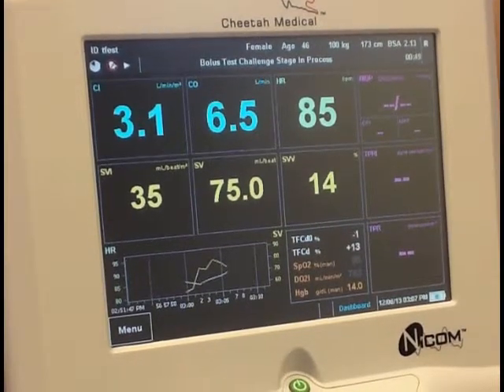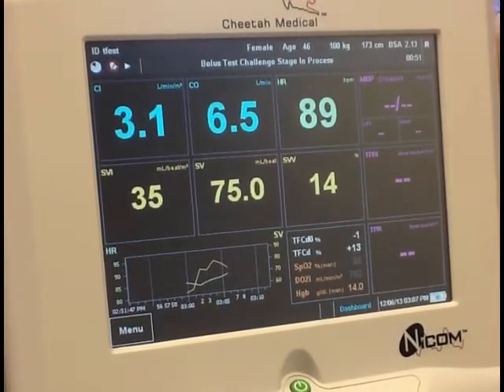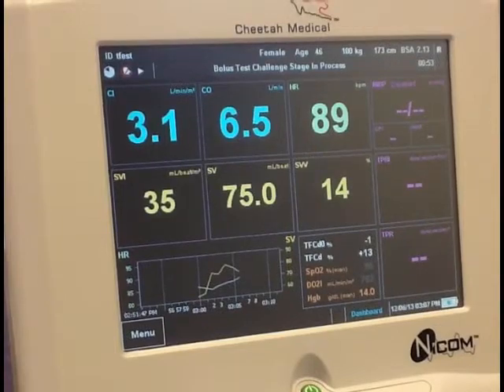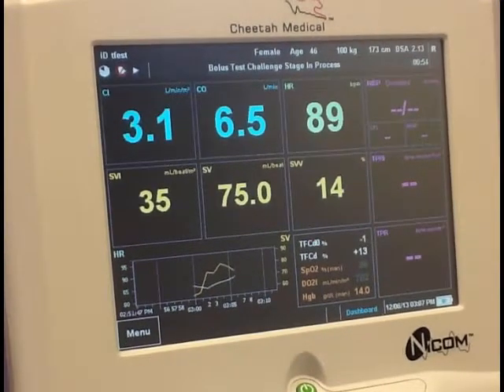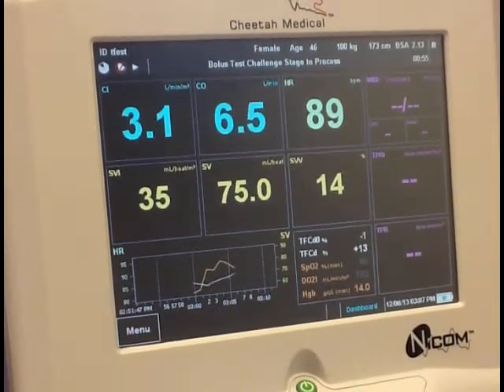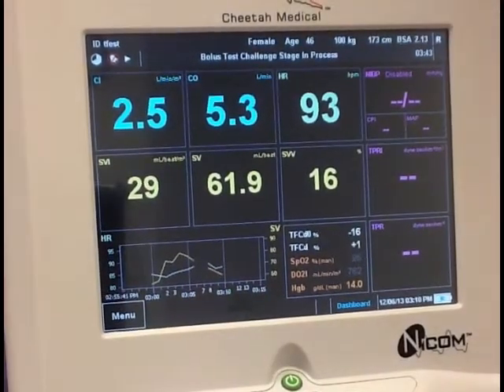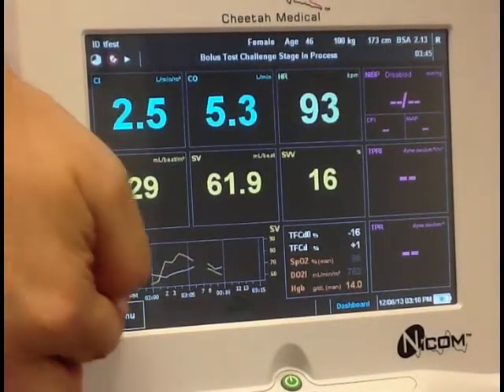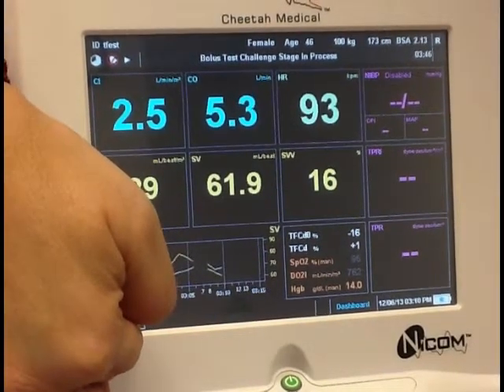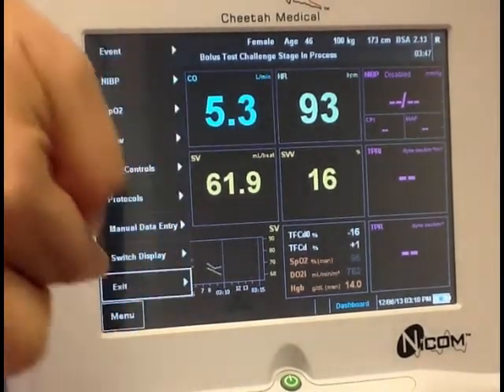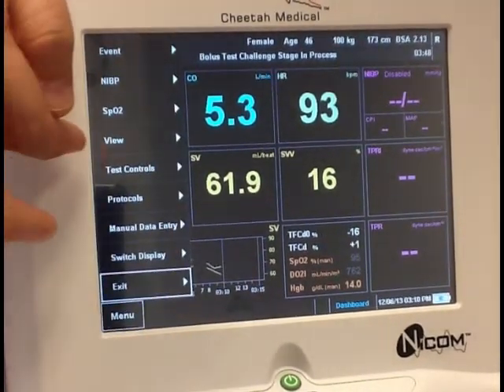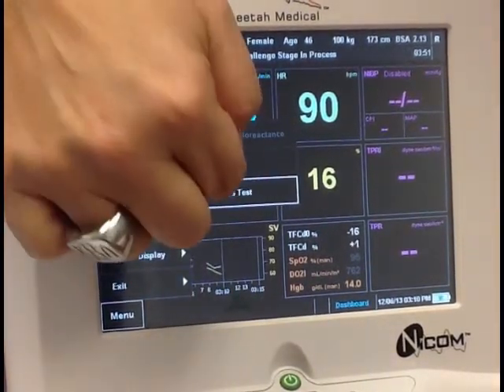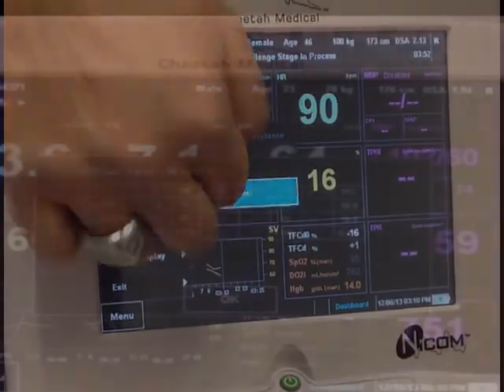Alternatively, the challenge test can be used to assess the response to an infusion of vasoactive medication. In order to end the bolus, you would want to go in, select Menu, Protocols, End Bolus Test.